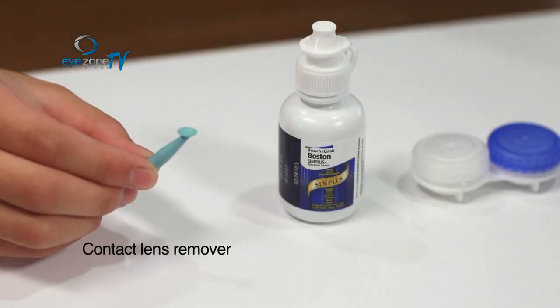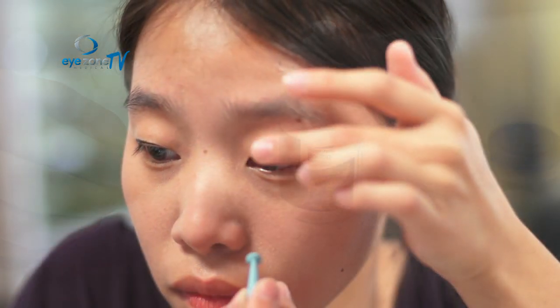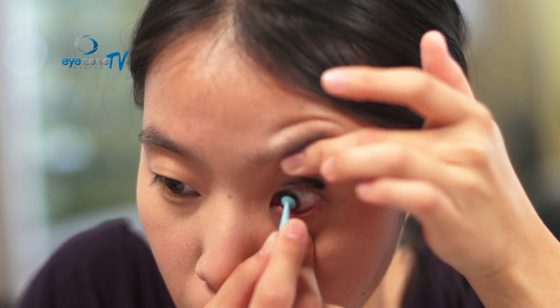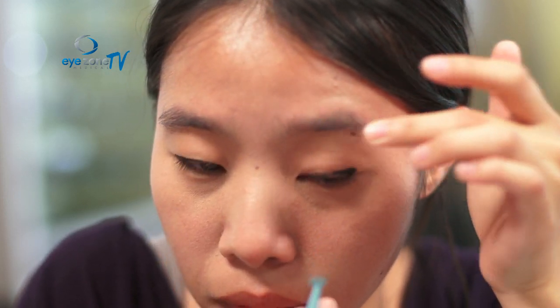This is the plunger used to take out the contact lens. It has a small suction cup at the end — when you push it against the contact lens, it grips the lens so you can pull it out of your eye without having to directly touch your eye.